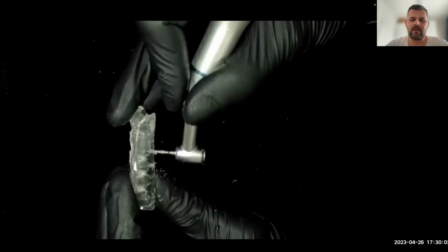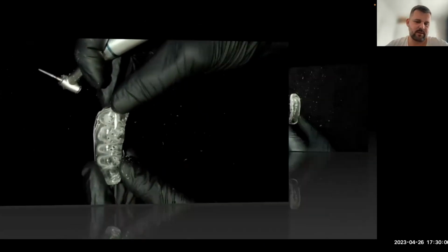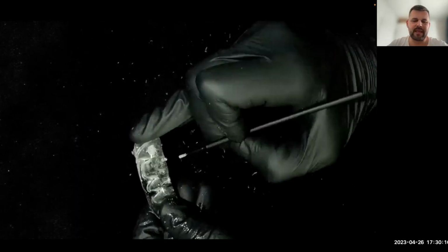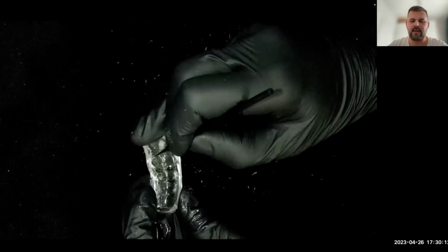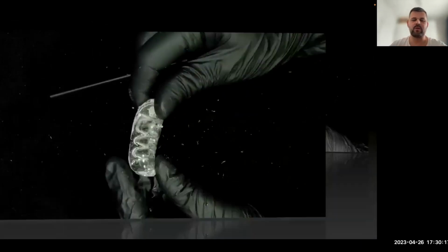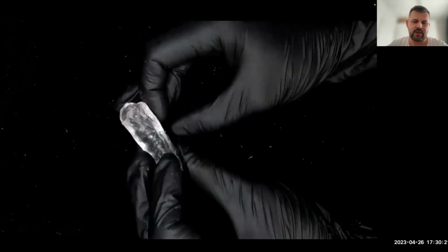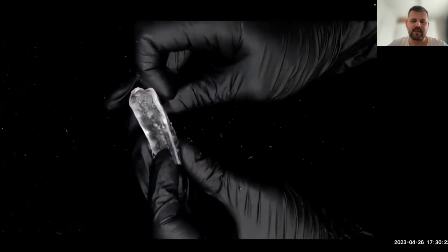But remember, when you make these holes, you need to clean it, because there's a lot of debris, a lot of plastic and silicone inside. So you need to use alcohol and clean it very well, because we don't want to have this inside the silicone index. And check that the tip of the composite fits perfectly.